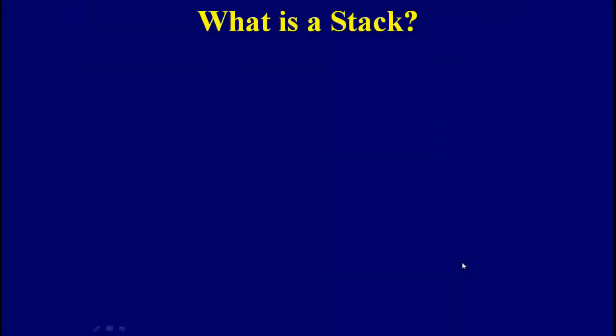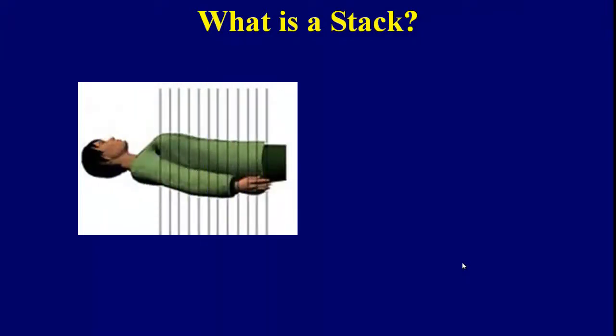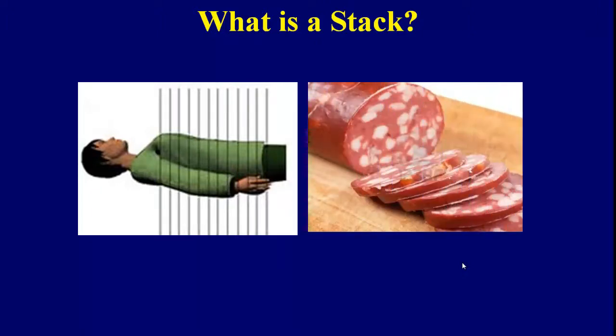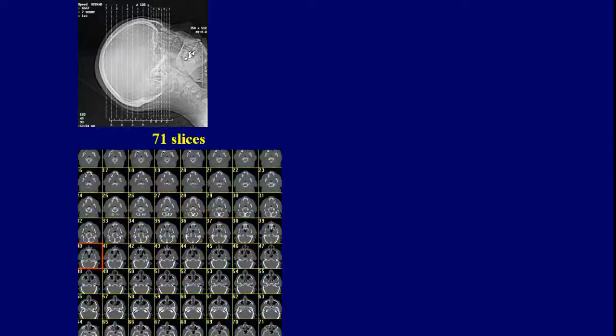What is a stack? A scanner takes a series of pictures as it slices through the body, much like cutting slices through a sausage. Here's a picture showing the location of different slices through the head of a patient. The result of this scan would result in 71 slices, all of which are displayed in this panel.